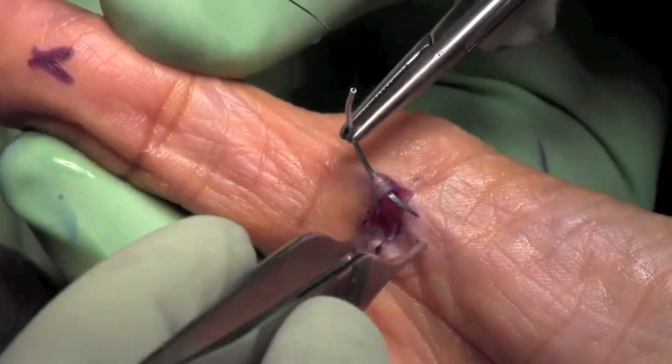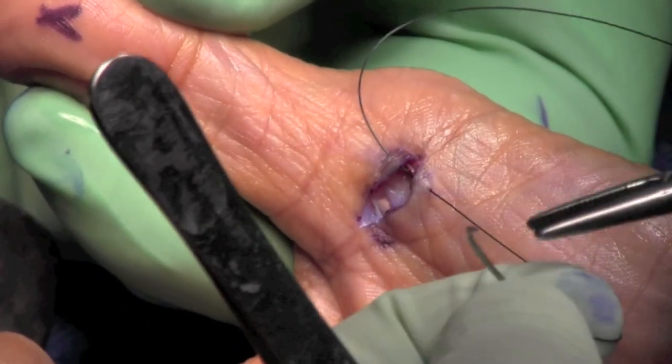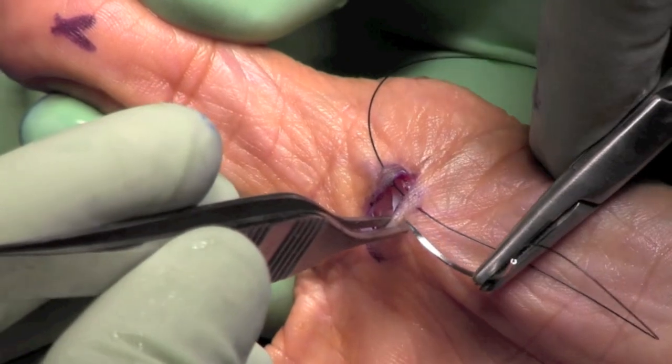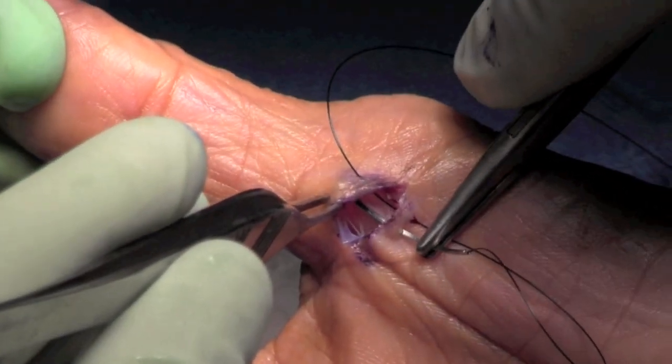The skin is now closed using a 3-0 nylon suture. Two mattress sutures typically take care of the closure. A soft dressing is placed and the patient is allowed active motion of the IP joint immediately.